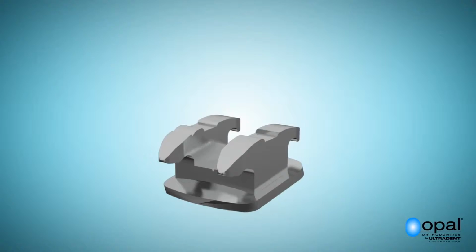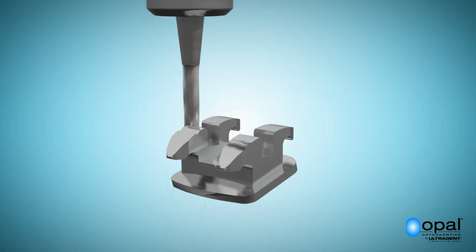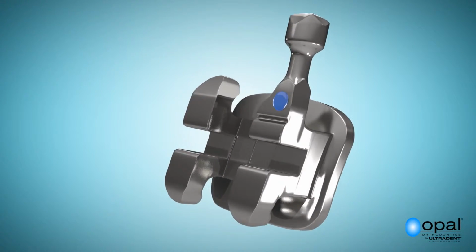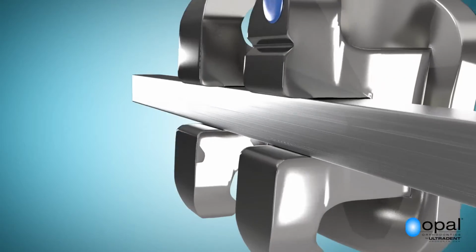With the metal injection molded part, you get shrinkage, which leads to a less precise wire slot. In the case of a CNC machine part, that wire slot can be repeated every single time within a very tight precision. A CNC machine bracket results in less torque loss due to the fact that there is less slop between the wire slot and the arch wire.